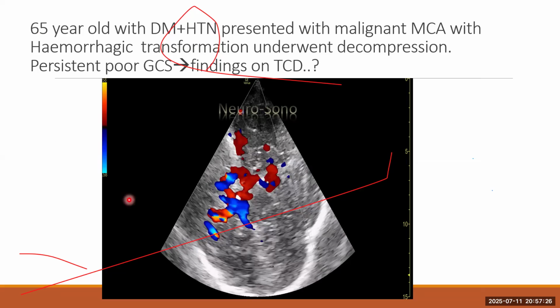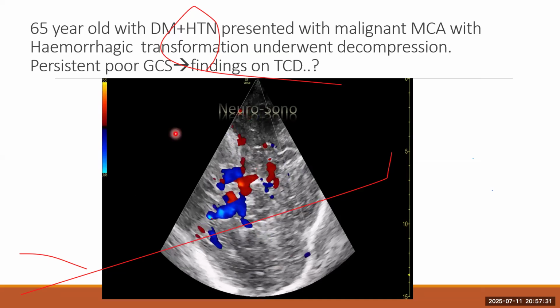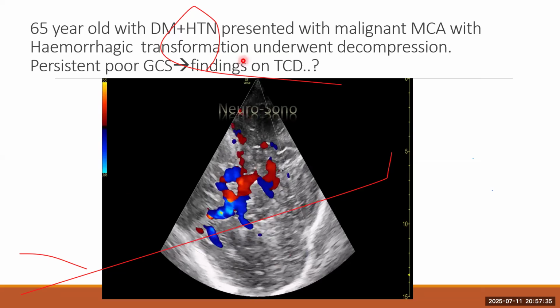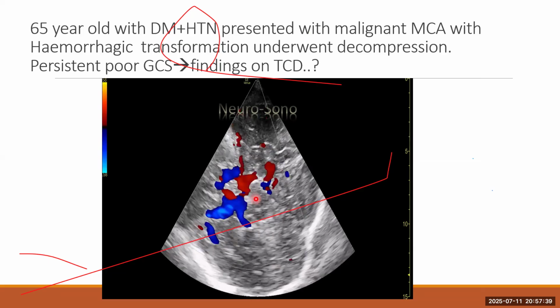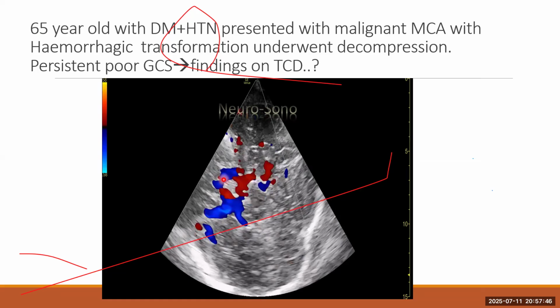What are the findings on TCD? Anyone can tell apart from Bharatesh? So this is the midline.